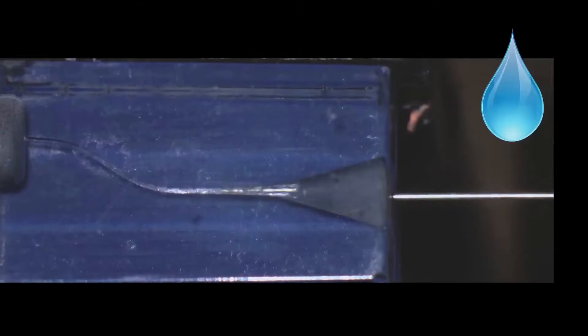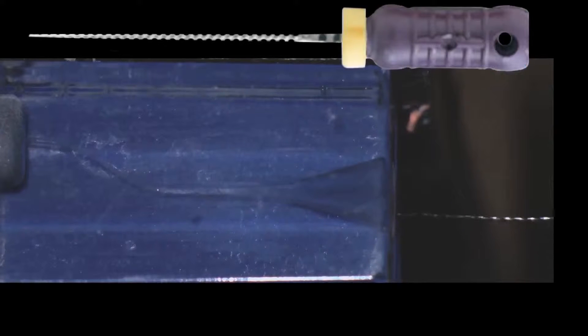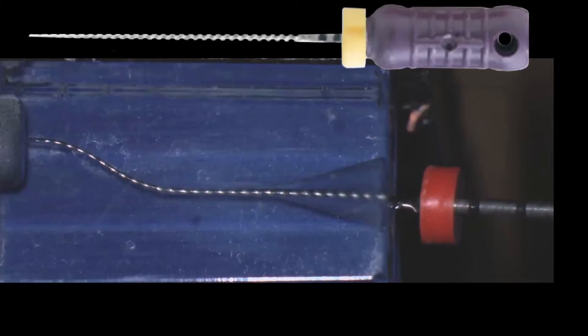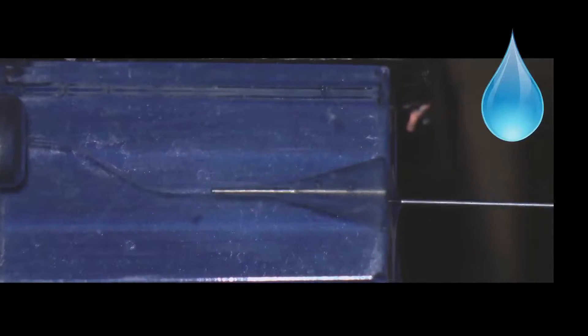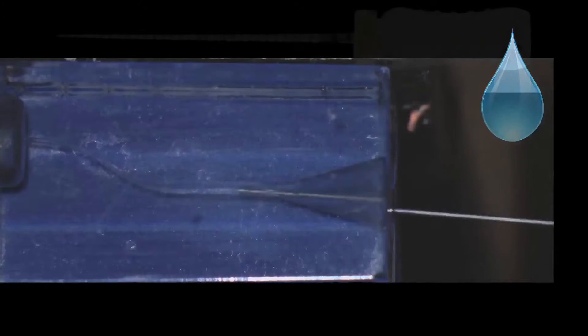We will be able to achieve a very good working length with WaveOne Gold. Let me take you through a plastic block. Here we have irrigation — a critical part of root canal therapy. We irrigate, then establish patency in the canals, going with a very fine instrument, a number eight or a number ten, to see that we are able to go just a little bit beyond the apex — not much, just half a millimeter to a millimeter. Every time a file is used inside the canal it requires irrigation. You can see how far the irrigation goes.